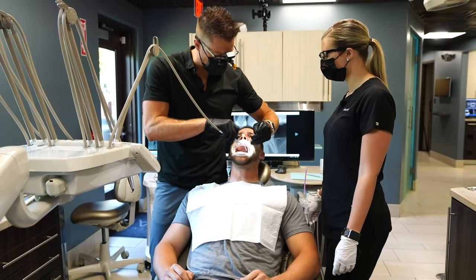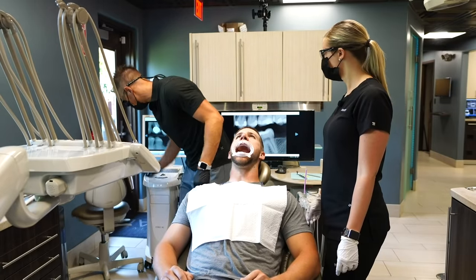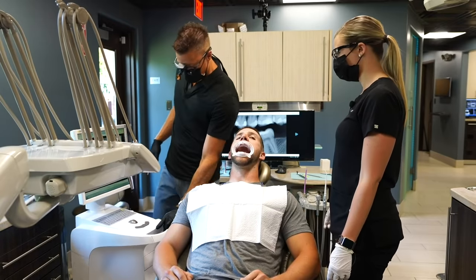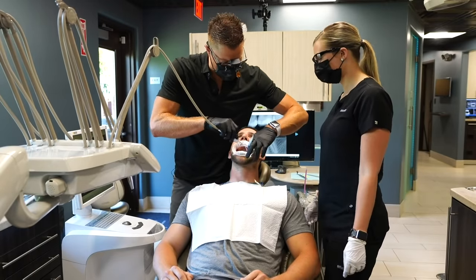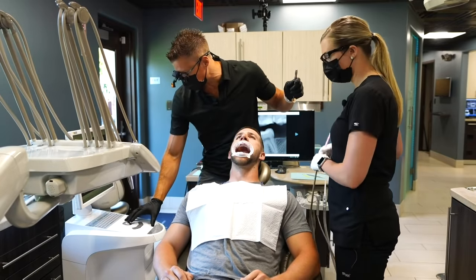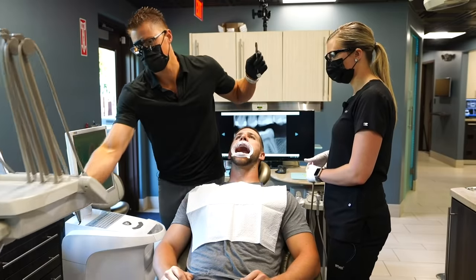Why would we want to just put an implant in the bone without any sort of defined plan for where the crown is going to go and work with the patient's bite? And so that's what this whole process is about here. And what we're doing today is a lot different than a stent. So I know there'll be some that'll say, well, we use a stent to plan the implant. Michael, are you on this now? I don't know if you've got that screen shared there.